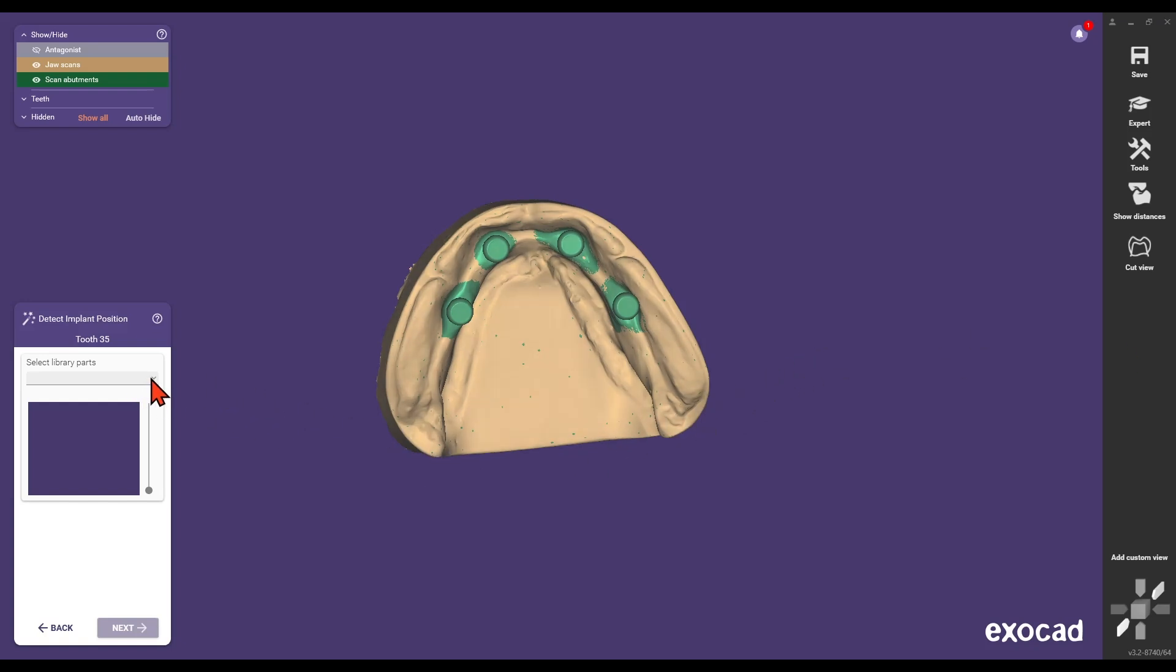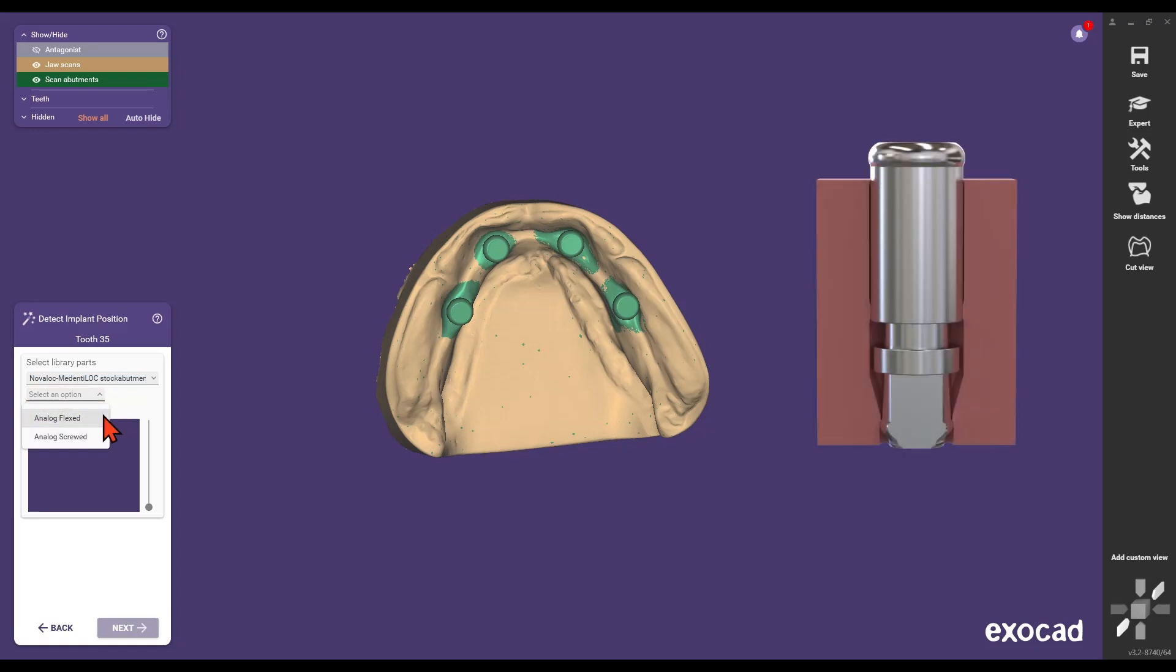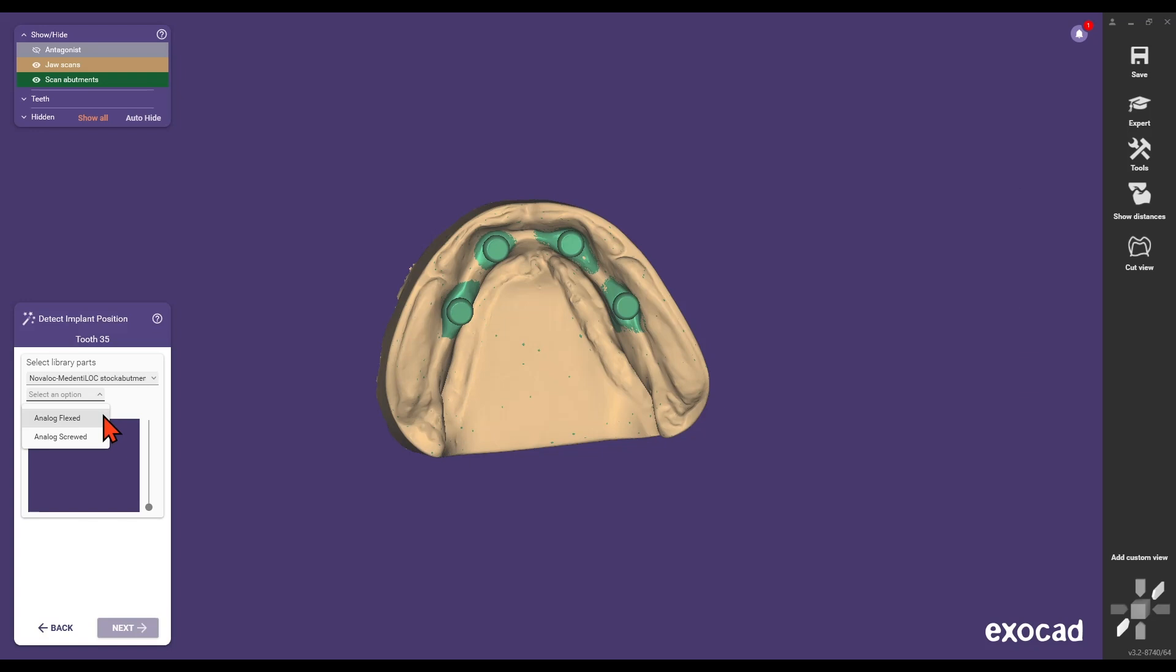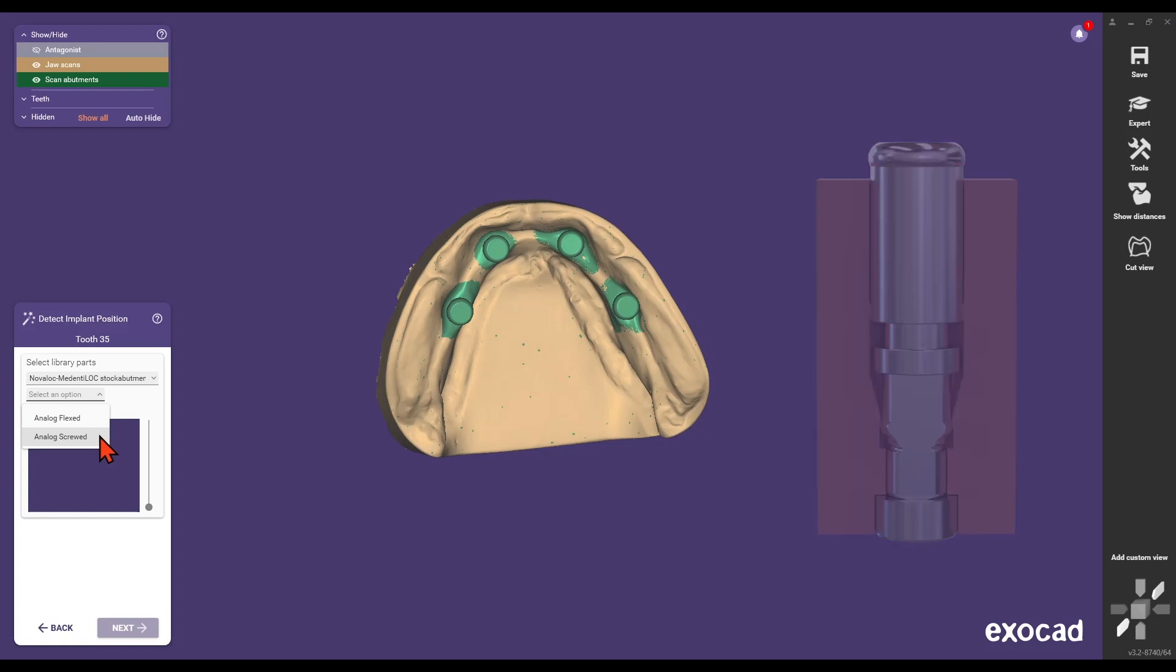For NovaLock and MedentiaLock laboratory implant CAD CAM, choose between option one: analog flexed for the shortened version, suitable for printed models that are only clickable, or option two: analog screwed for the long version, suitable for printed models that are clickable and screwable.